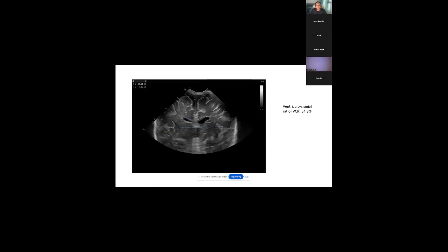Okay. Then we just did the VCR, which was 34.8%, which I think from reading the literature, between 33 and 36 is normal. Yeah.